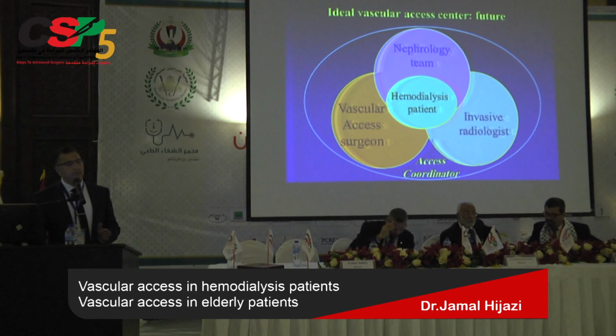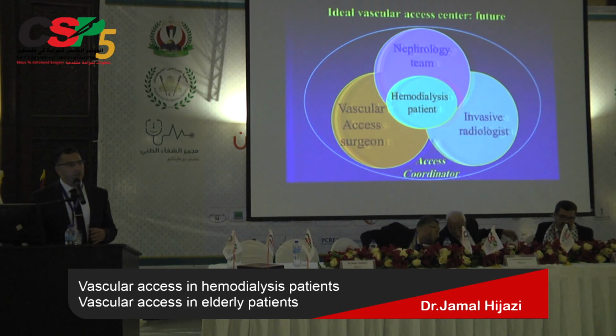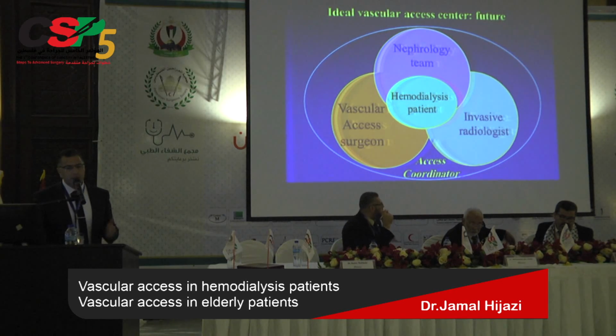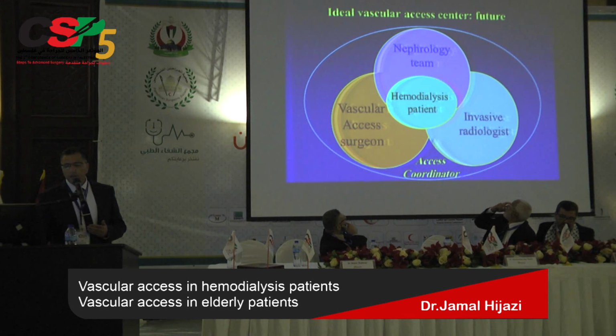If there's any problem with the fistula, we have to send the patient to an interventional radiologist to deal with this problem. For example, if there's any central vein stenosis or puncture site stenosis, we have to do PTA to save the fistula and to maintain the patency all the time.